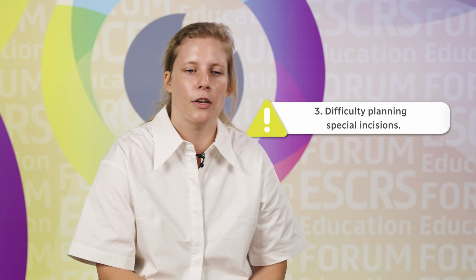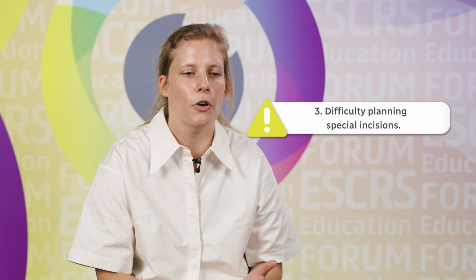For the intraoperative visualization, without digitalization, you have to mark the axis on the patient's cornea before the surgery starts. For that, the patient has to sit in an upright position, and it should also take place before any sedatives are given to the patient. So that is definitely an interruption in your workflow. And what are you doing if you're planning any special incisions like opposite clear cornea incisions and so on? You cannot mark every axis on the cornea. That would be too confusing during the surgery.